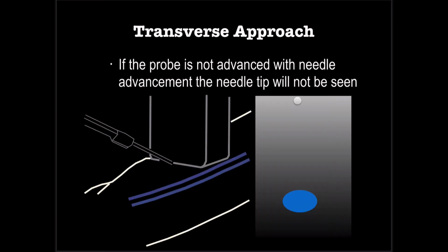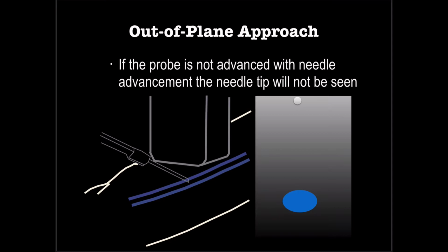So they start off right, and we've got the needle down the vein at the bottom, and the needle is all lined up. It's ready to go. But instead of advancing their transducer, they stick the needle in. So here we are. We're going to stick the needle in. Well, because we didn't move our transducer, the picture never changed. The needle still looks like it's at the top. But it's really not the top. It's advanced down into the tissue.